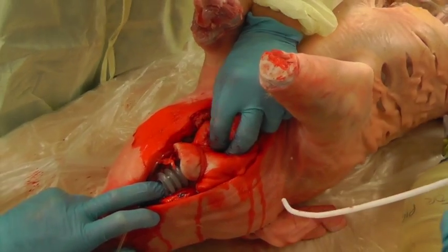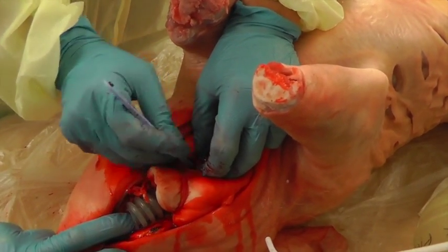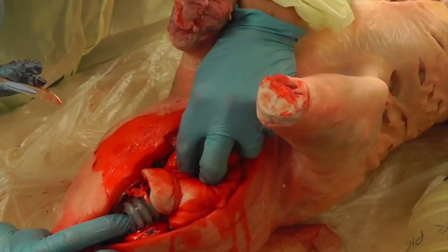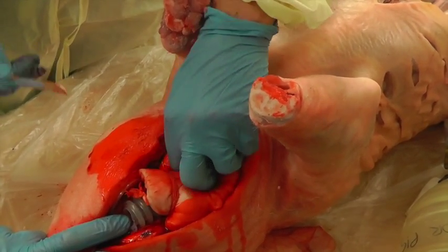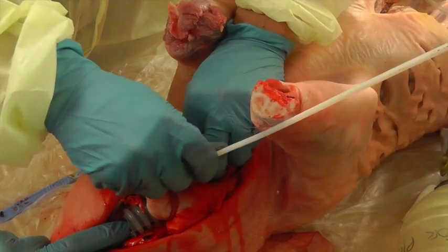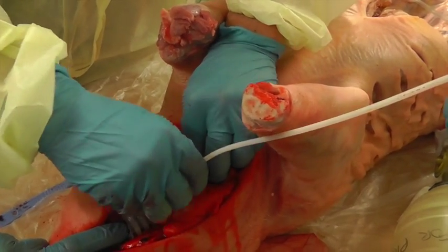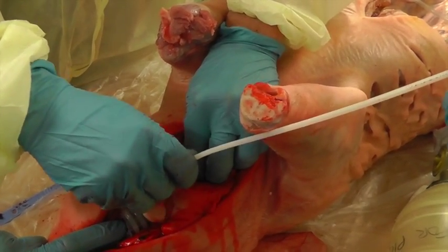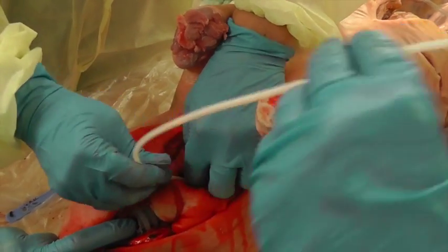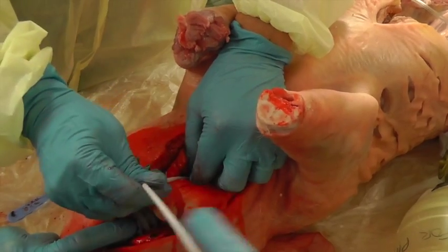Feel the cricothyroid membrane. I'm going to make a stabbing, rocking incision. I'm placing my finger in — I can feel my finger's in. Pulling it slightly out. Placing the bougie down beside my finger. And that's not in — now it is. I'm pausing a moment; I can definitely feel that's in.